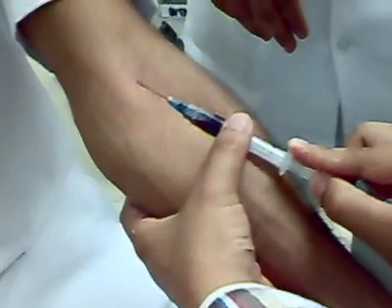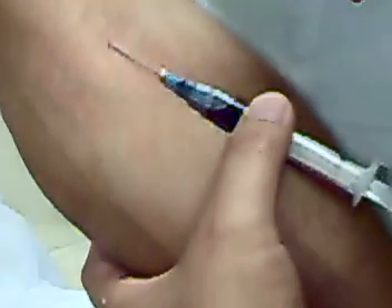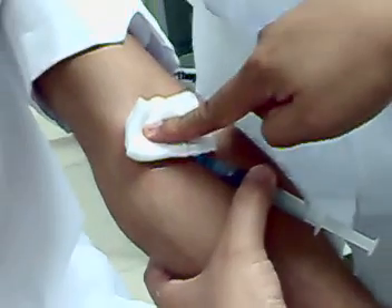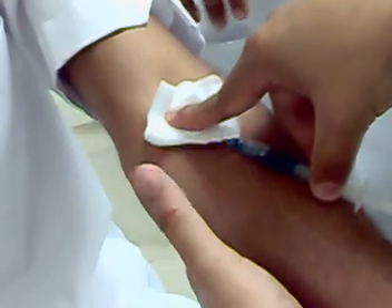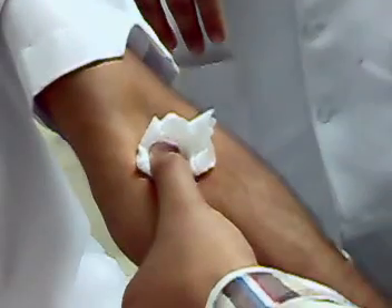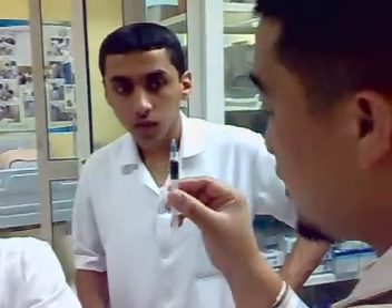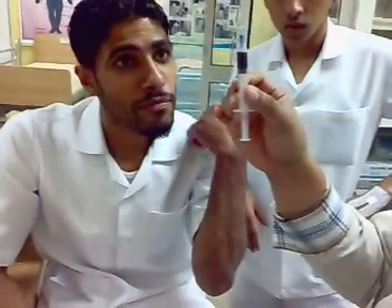Can you see the blood now? There is blood. In the hospital, you will get 10 ml of blood. Putting this with my four fingers, I will hold this back. So now I can remove my thumb and put it there and remove. This is your blood. As you see, the color of the blood is dark red because it is in the vein. If you see blood from the artery, it is light red because it has a lot of oxygen. This one has a lot of carbon dioxide.